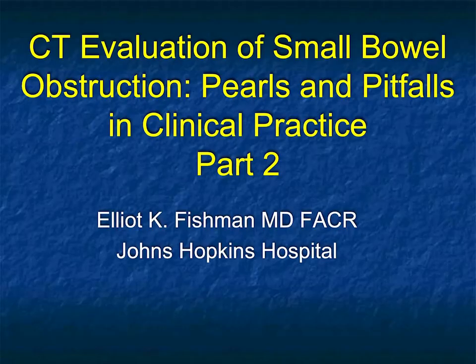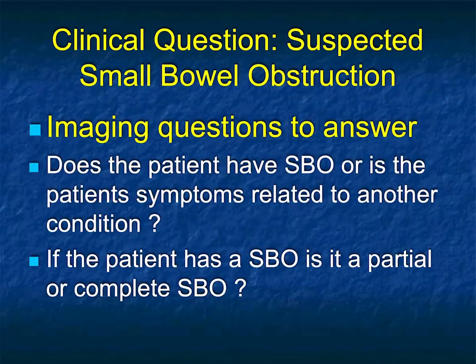Hi, welcome to part 2 of our evaluation of small bowel obstruction. Now, we left off last time with really beginning to think about how we evolve around the clinical question. What do we need to answer?